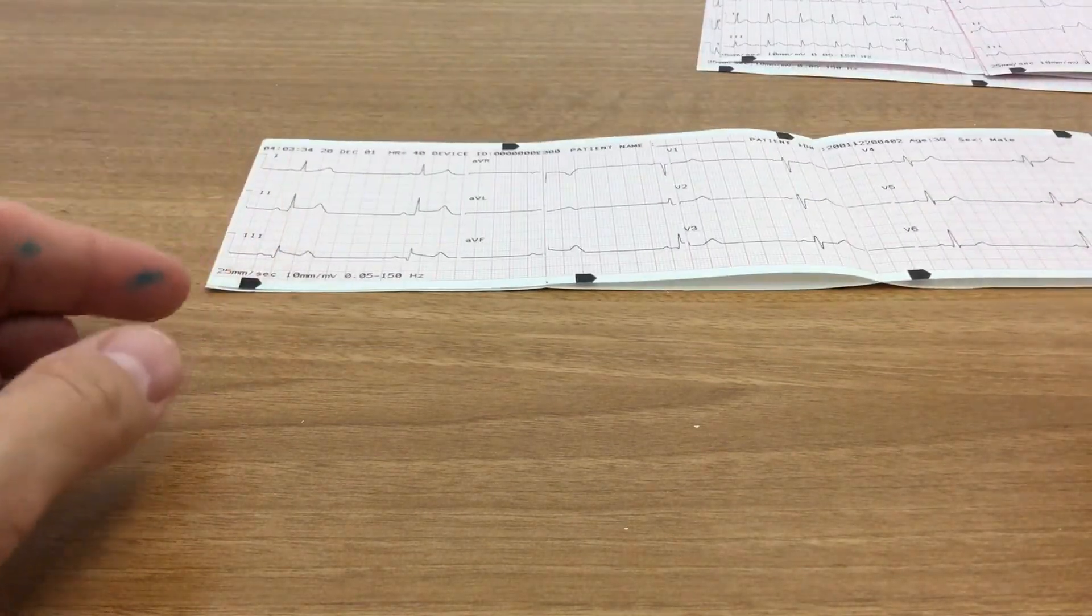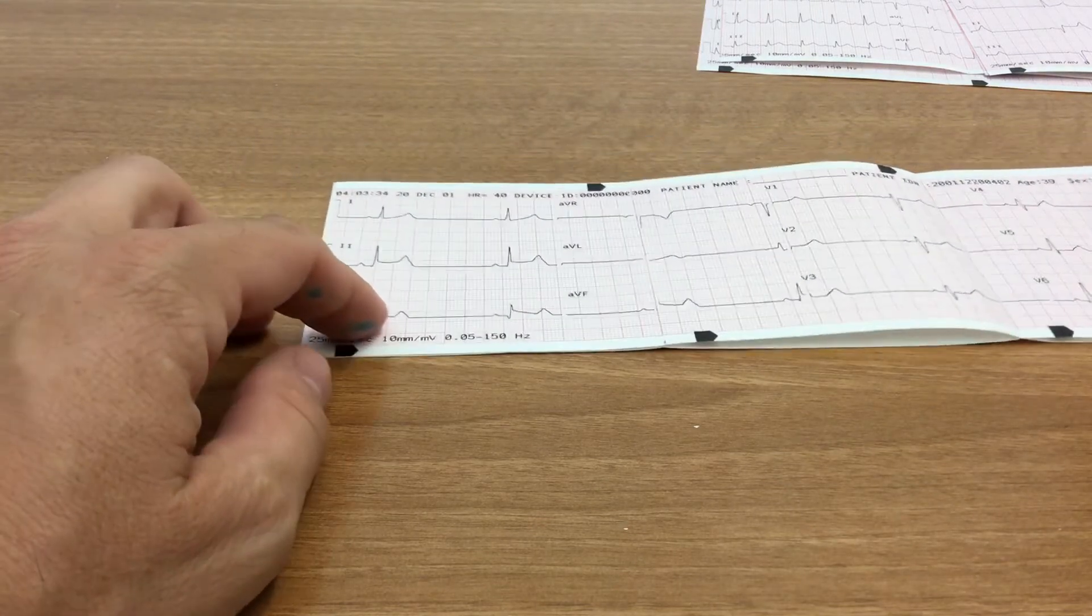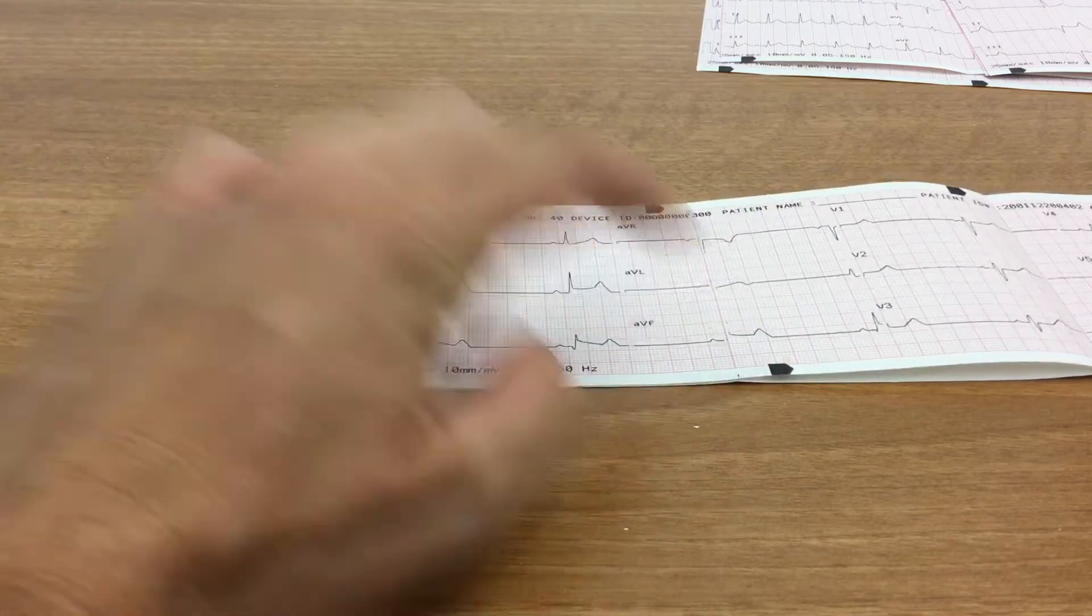And so again, what I like to do is I like to go through that ISAL method. So let's start with I, the inferior wall, 2, 3, and AVF.